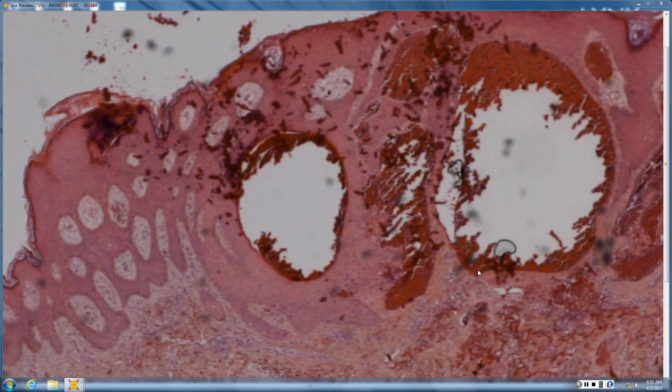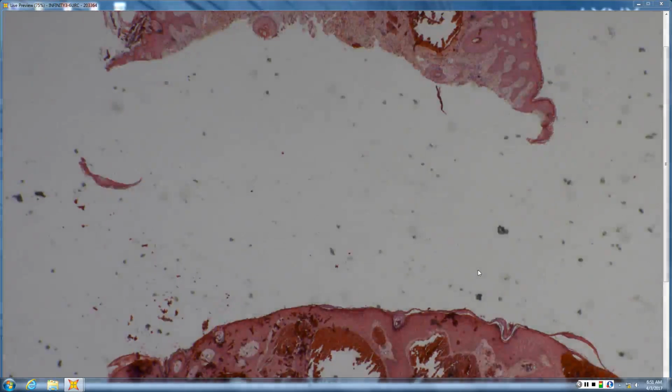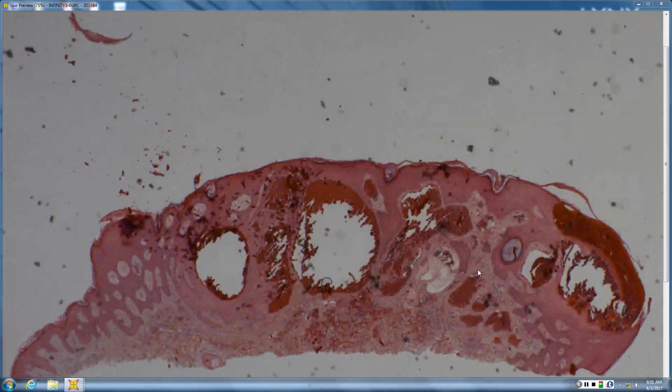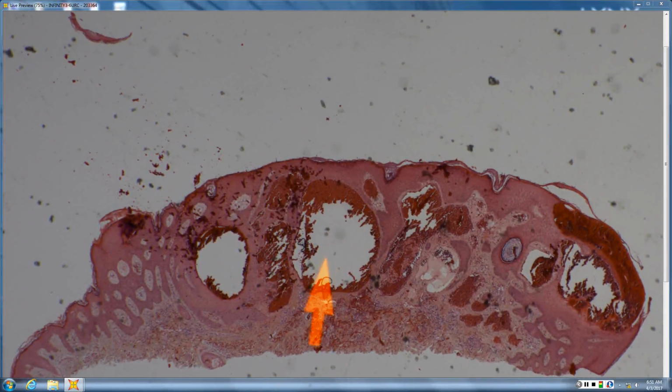All right, so we're doing Chapter 23, Vascular Tumors. So this first one is an angiokeratoma, and from scan, I like the description in Elston's book where he says basically it's kind of like this really bloody hemorrhagic SK. And that does help you to delineate between an angiokeratoma and a lymphangioma, because lymphangioma can be very bloody sometimes, but it's not necessarily the amount of blood that makes it an angiokeratoma.